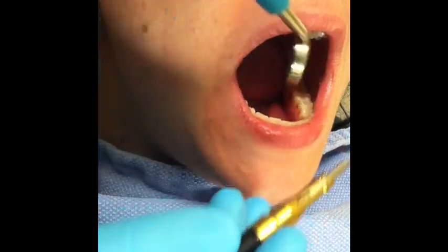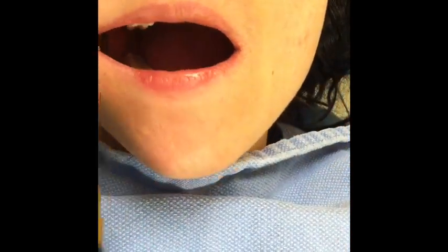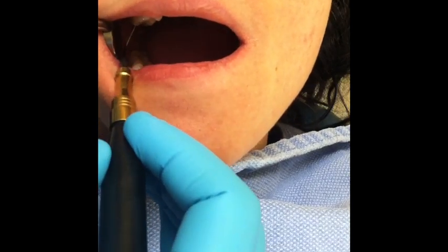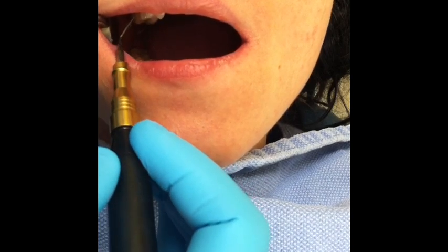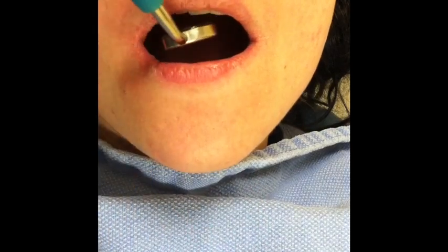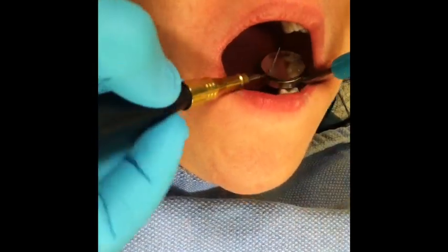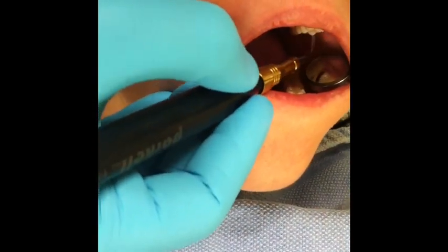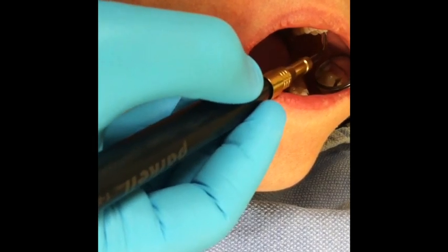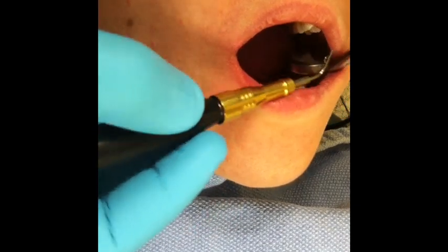My movements are a little bit awkward because I'm using the iPhone to record the video, and I have it attached to the overhead light - it's very close to the patient right now and actually getting in the way. It'll just be a lot smoother than this normally. You get a nice view of the buccal of the upper molars, and you get a good view with suction while you're scaling.